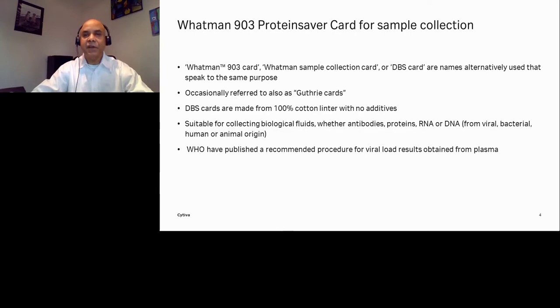The detection of markers of other diseases, such as human chorionic gonadotropin in Down syndrome, glycated hemoglobin in insulin-dependent diabetes, and the estimation of drug levels and abuse of drugs, have also been investigated. The limitations of sensitivity and specificity when screening such a small volume of blood, such as 5 to 10 microliters, restricted the use of dried blood spot for many years.